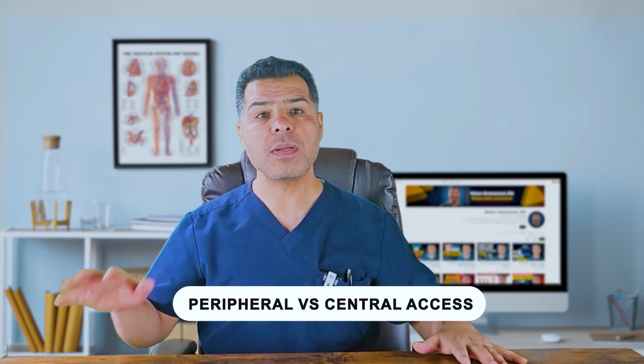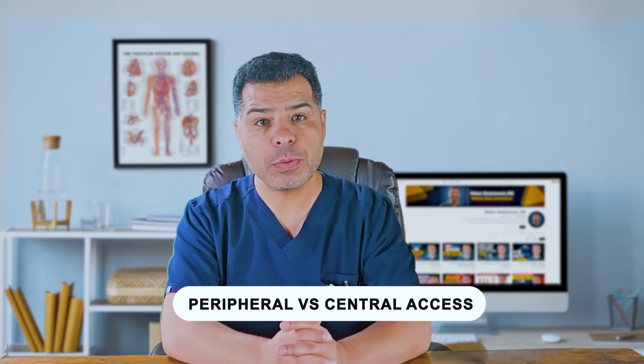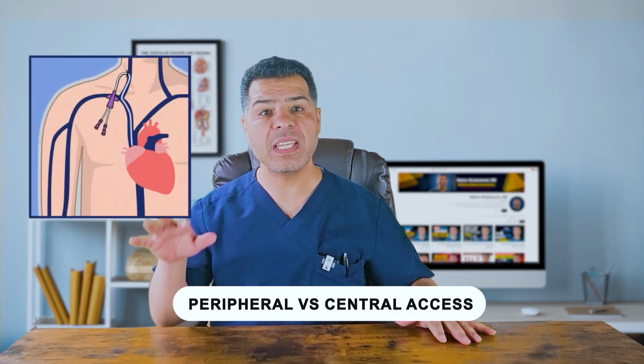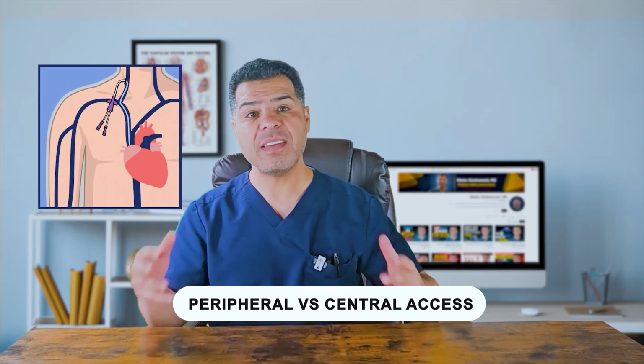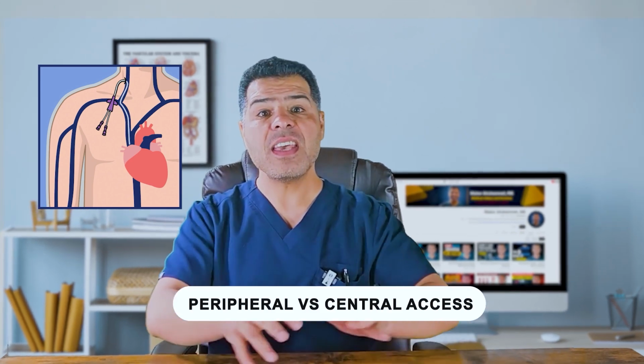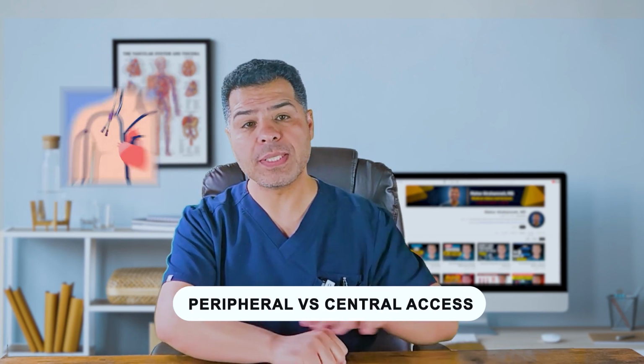Now let's talk about central accesses, meaning the catheter tip ends in the central circulation. We'll start with the non-tunneled central lines. These include internal jugular, subclavian, and femoral central lines. They are used for short-term access, usually less than 2 weeks.